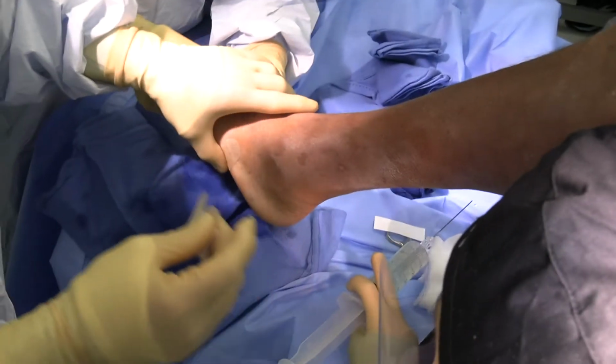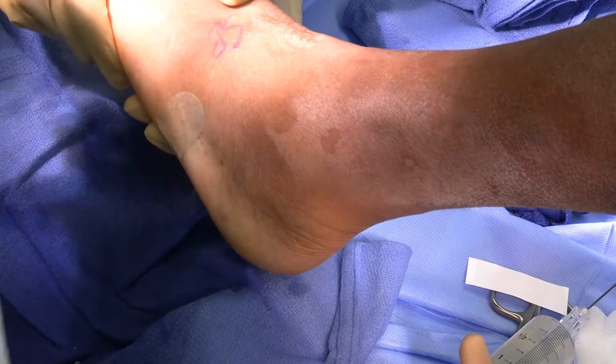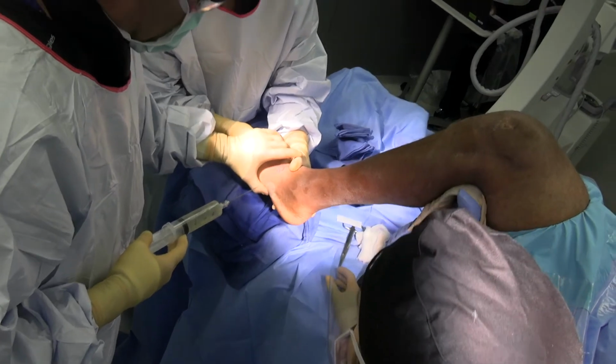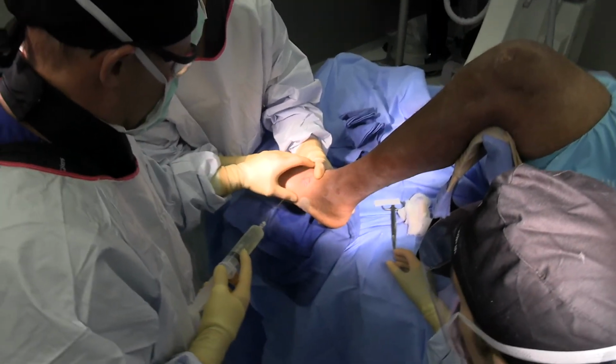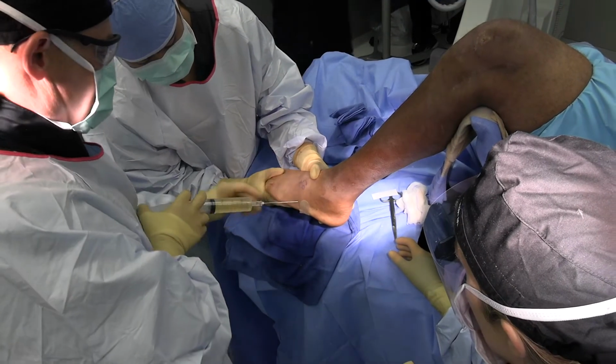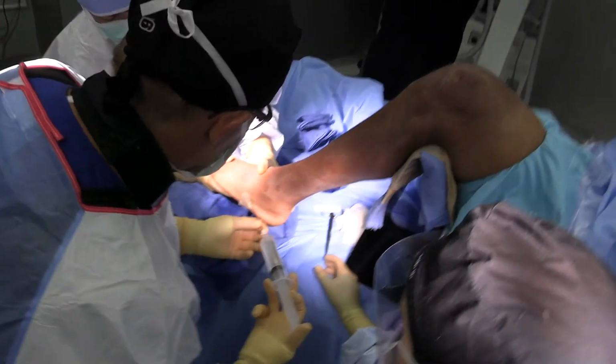Basically just leave these little steri strips in place until the wound heals in about a week. They can take a shower today. They can walk on it as well today. And then what we want to do here, the very important part, is the anesthetic. So we also have some platelet-rich plasma in here to promote healing.